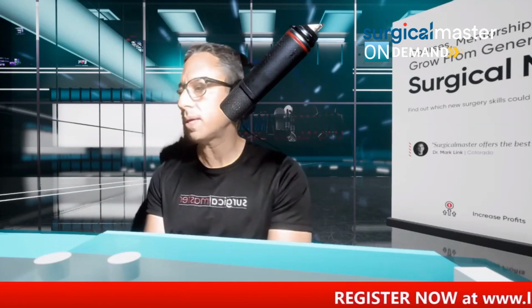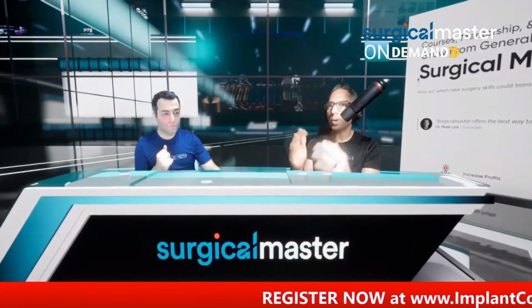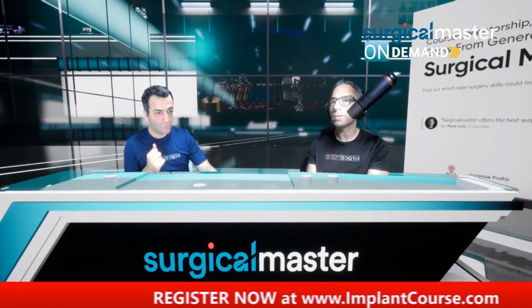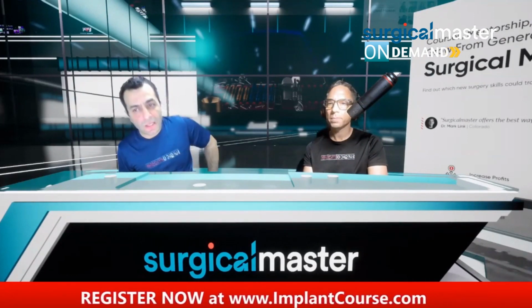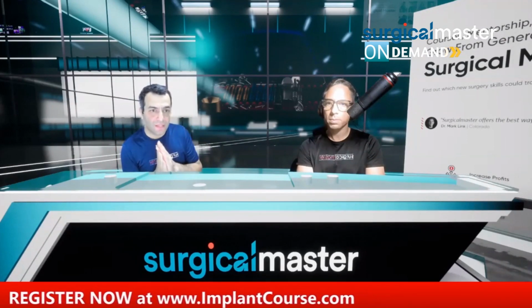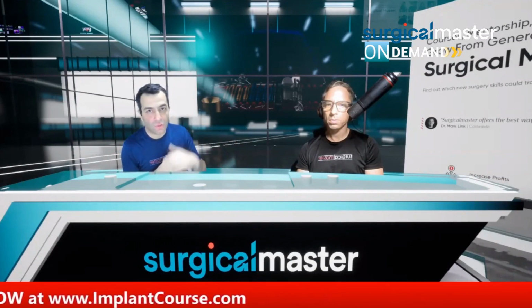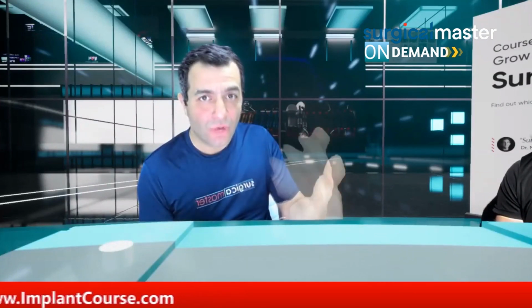Rashad, tell me something that I can maybe explain. To create a 4 millimeter width or diameter osteotomy, you need to use a 4 millimeter drill. I think it's pretty clear. I just think, sometimes when you haven't done something or haven't studied it or gotten mentored on it, it's not that clear. And that's normal. It happens with anything.